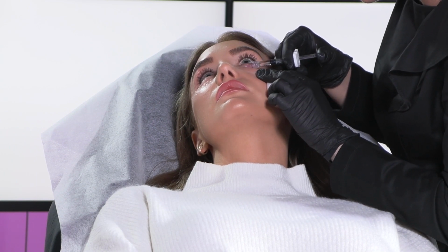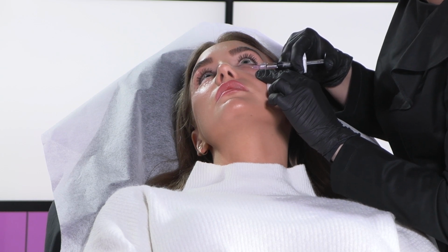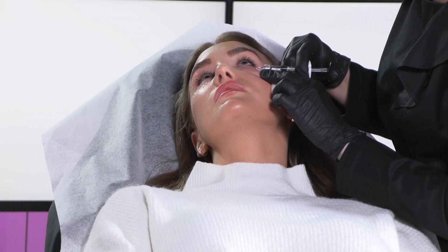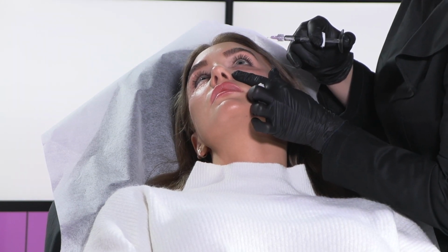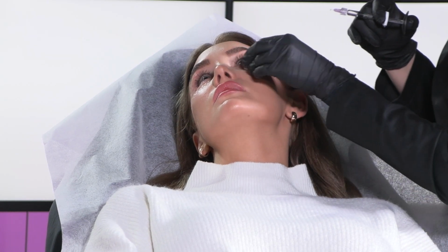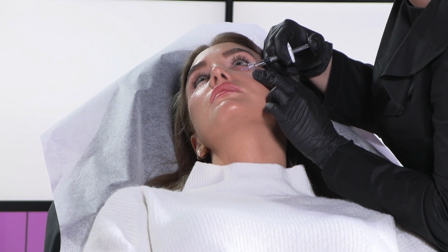And we come close. Small, small drops of papules of the product. I usually stretch the skin with the fingers. It helps me to avoid bruises in this area. It's just like a life hack, but I'm sure everyone knows this.